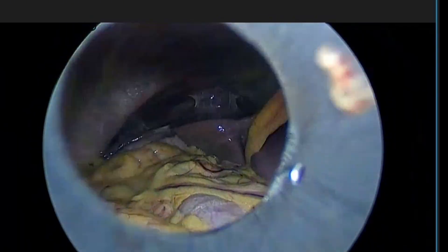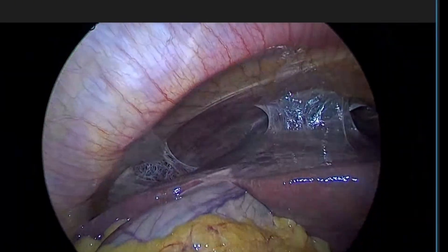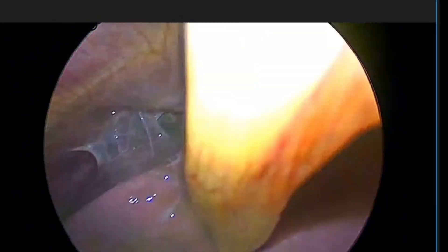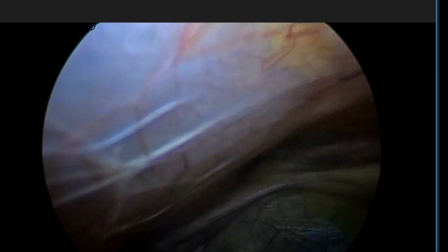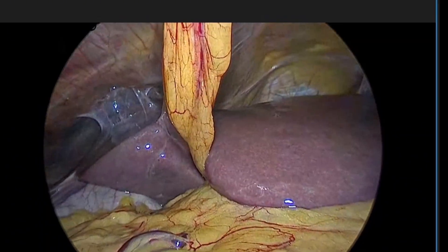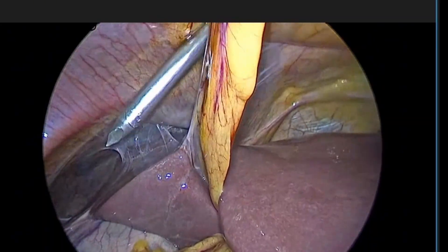As we are doing under spinal anesthesia, we keep pressure 12 millimeters of mercury and flow 3 liters per minute. The first port — the umbilical port — is going inside. You can see that the liver is in place, adherent to the anterior wall.